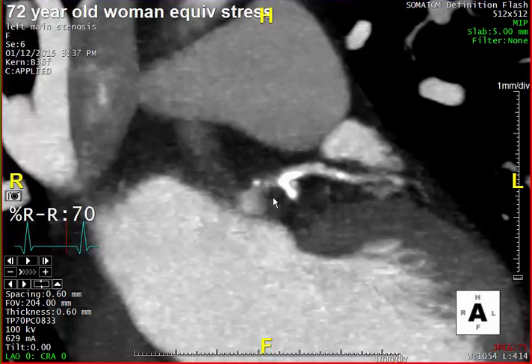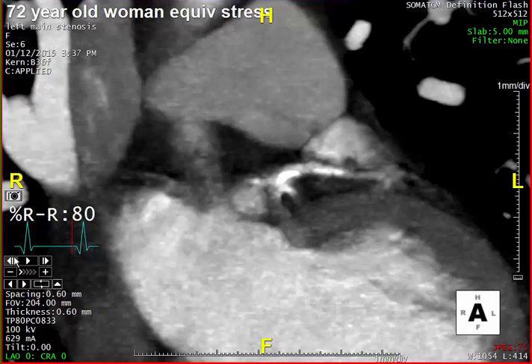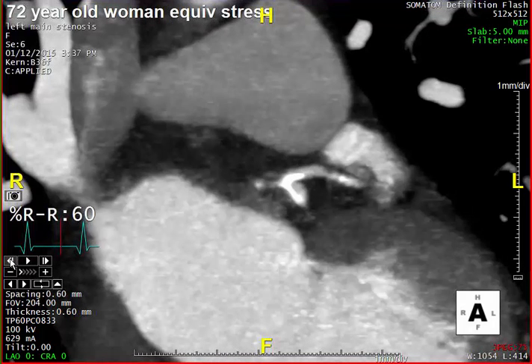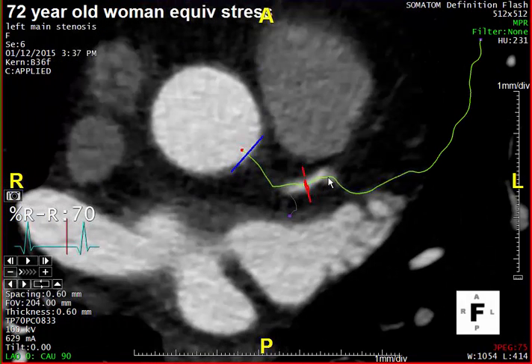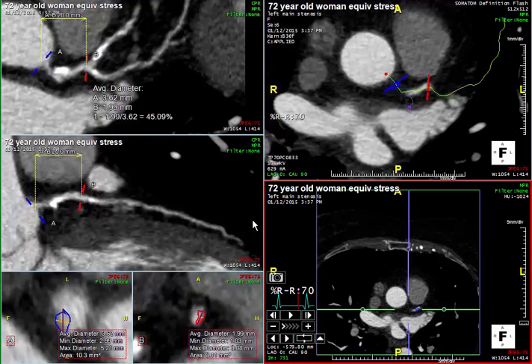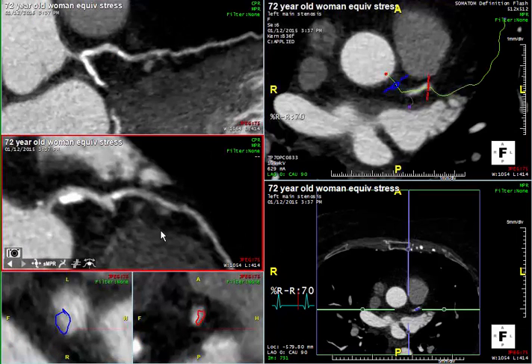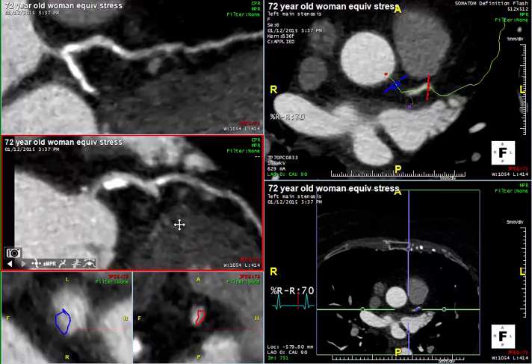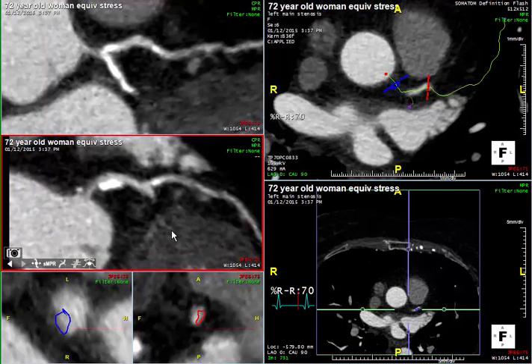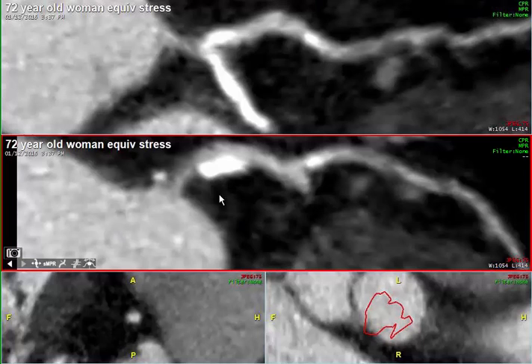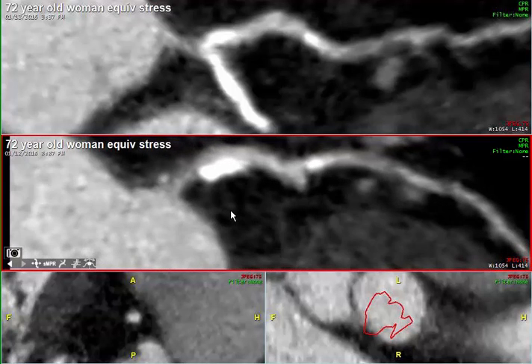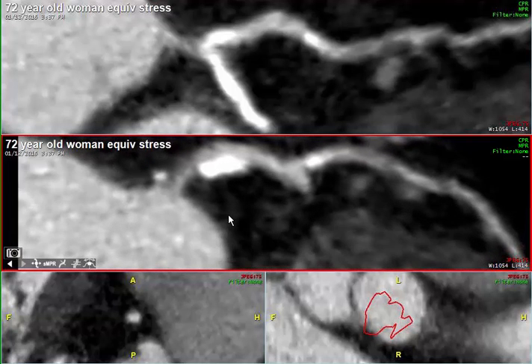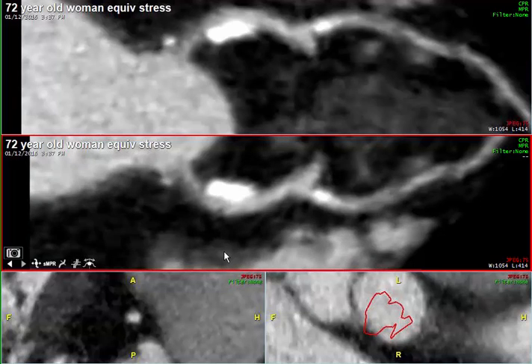I try here a variety of ways to see if I can improve on my initial assessment of the two-dimensional MIP by trying to do some thin sectioning and looking at maximum multi-planar reformats. These can be very helpful. You can see here again the left main — it looks like there's really no major obstructive disease, at least in the LAD distribution, but there clearly is what appears to be severe disease at the proximal left main.